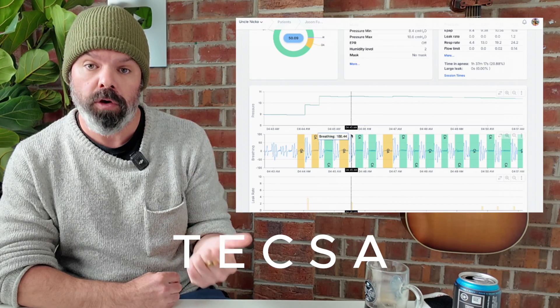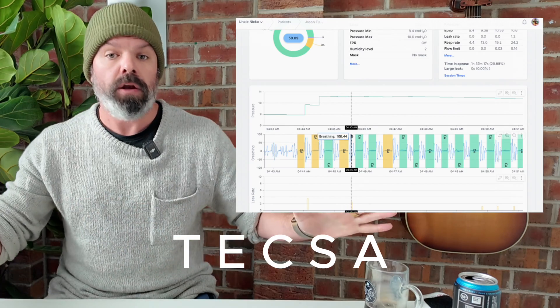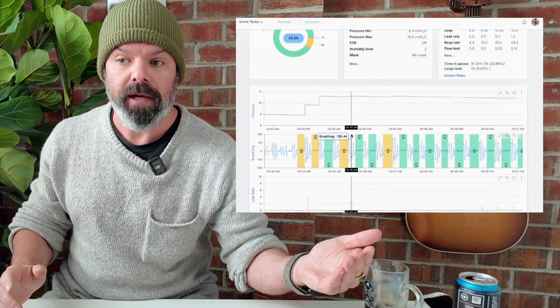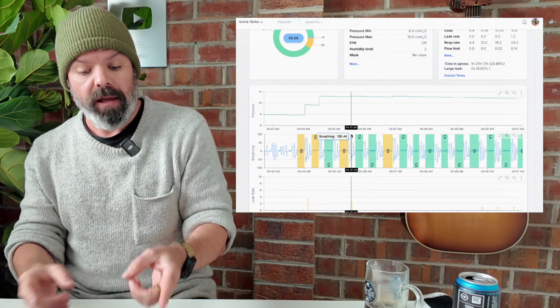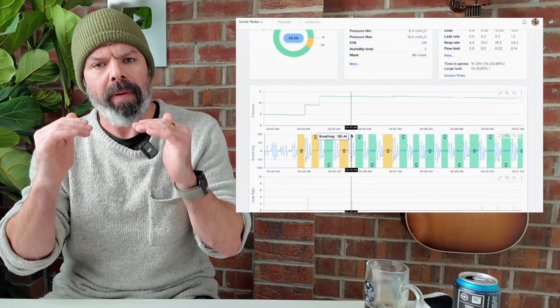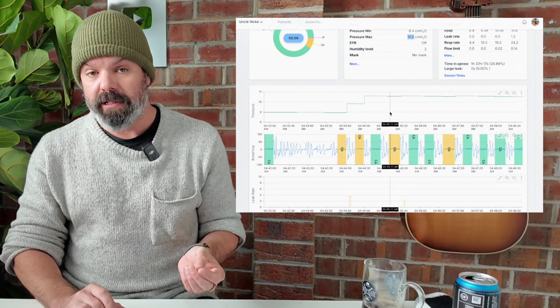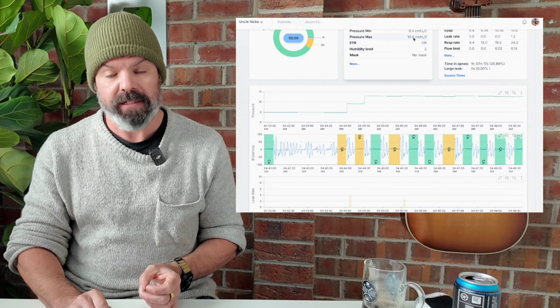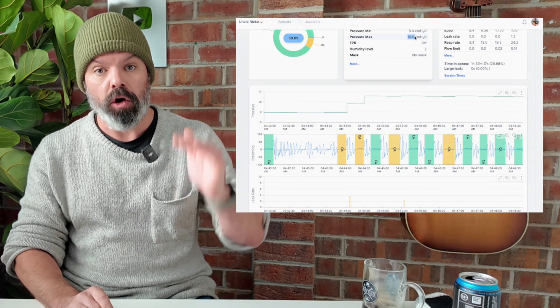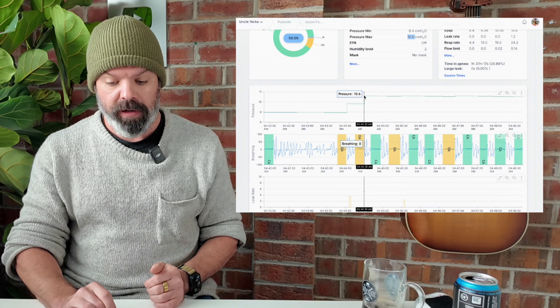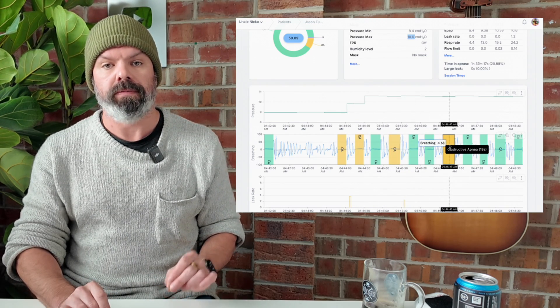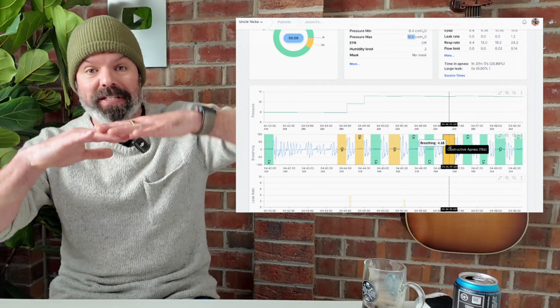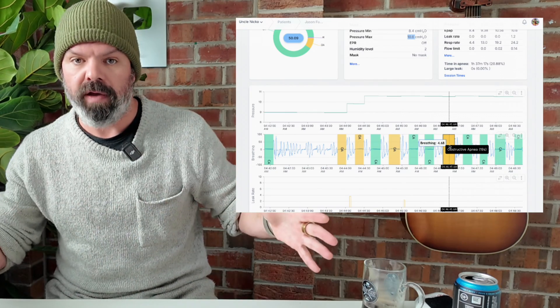So this is contributing to the clear airway events. Treatment emergent central sleep apnea. These are people who previously had no central sleep apnea. They start CPAP therapy and then they start having all these clear airway central events. Why? Because of this. It's the body, once again, trying to balance everything out, balance out that pH. And like I said previously, he's kind of lucky that he's got his pressure max set to 10.6 here. The machine can't go above 10.6, otherwise we would have made the breaths even larger, blow off more CO2, more clear airway events.